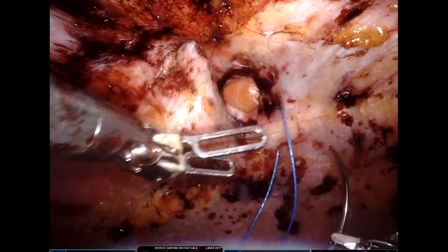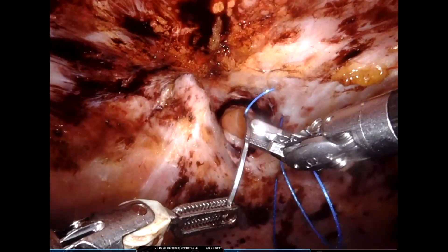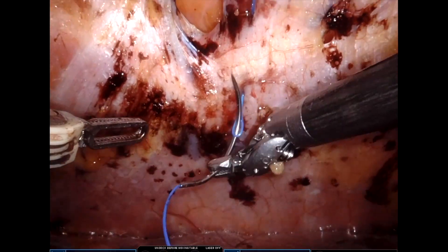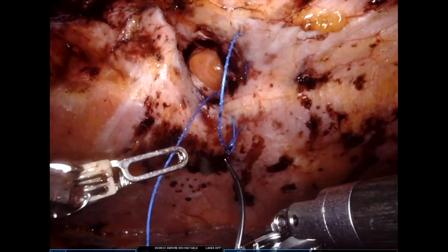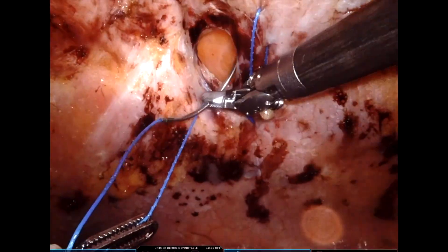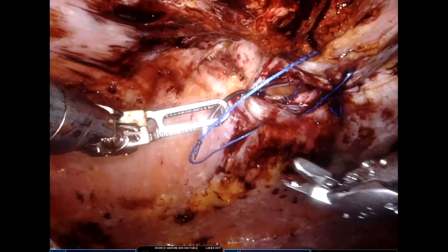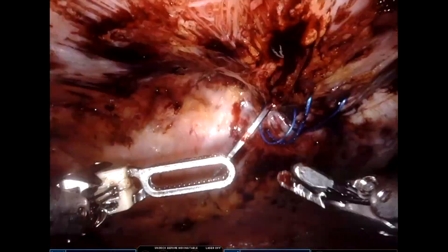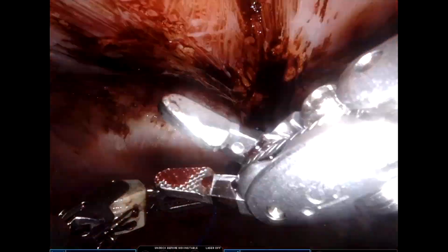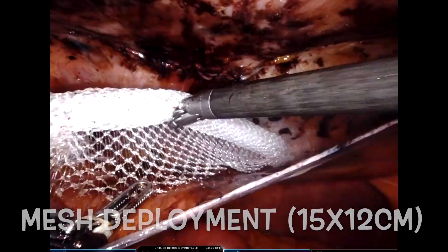We use barbed 1-0 non-absorbable suture for defect closure. After taking a few rows of sutures, we reduce the intra-abdominal pressure to 6 to 8 millimeters of mercury and then approximate the sutures. Here we are closing the hernial defect as well as the umbilical ring area, and then divide using the suture-cut needle driver.